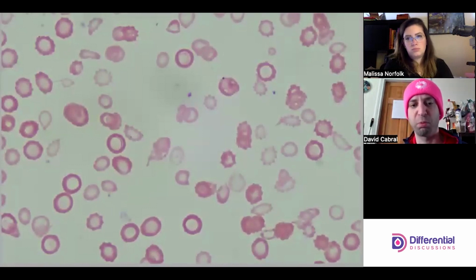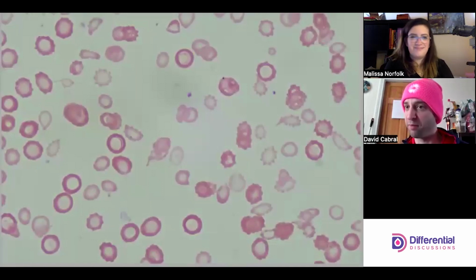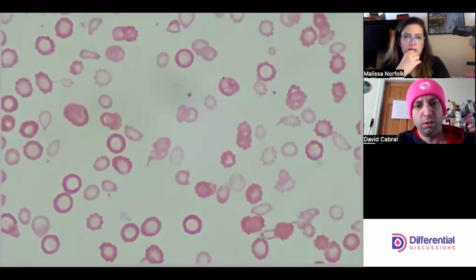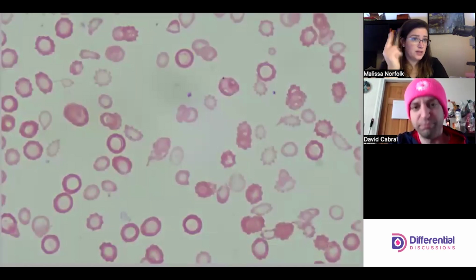I think it's important that it's called. It might be something that gets overcalled, and that can be a little difficult, but undercalling could be problematic as well. I would hope that the general metabolic testing would show the things the clinician really needs to see too, but this would be a great supporting evidence for diagnosis. Yeah. And so I think just looking at the other morphology, maybe schistocytes, definitely microcytosis, hypochromia, if the institution calls them.